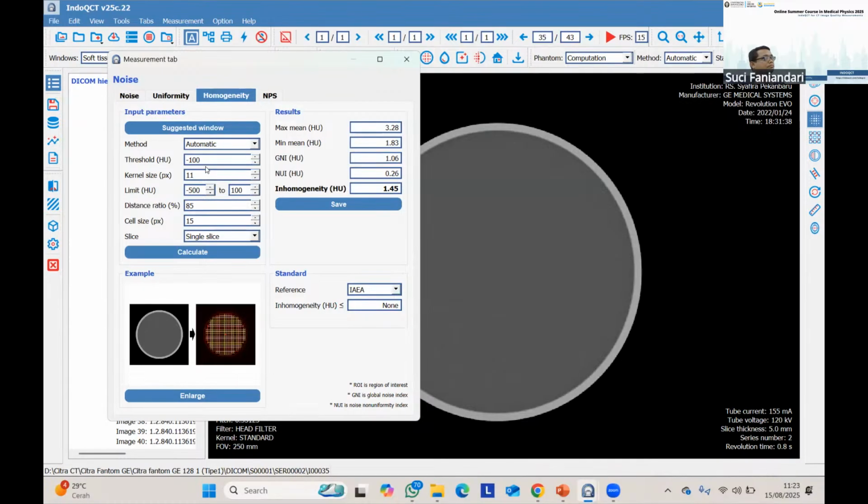Okay, thank you for the answer, Dr. Anam. We continue with the question from Mr. Amos Toka. Is there a standard ROI number for NPS measurement, or is it optional for study purposes? Yeah, it is optional. If you use more ROIs, it is better. Many studies use different locations.